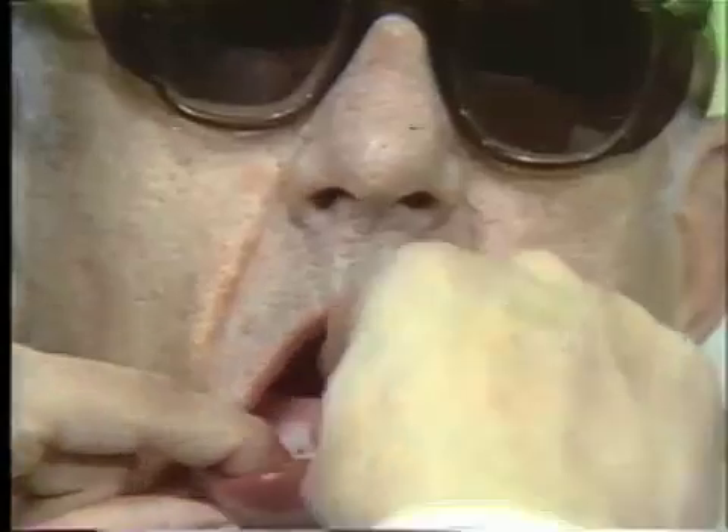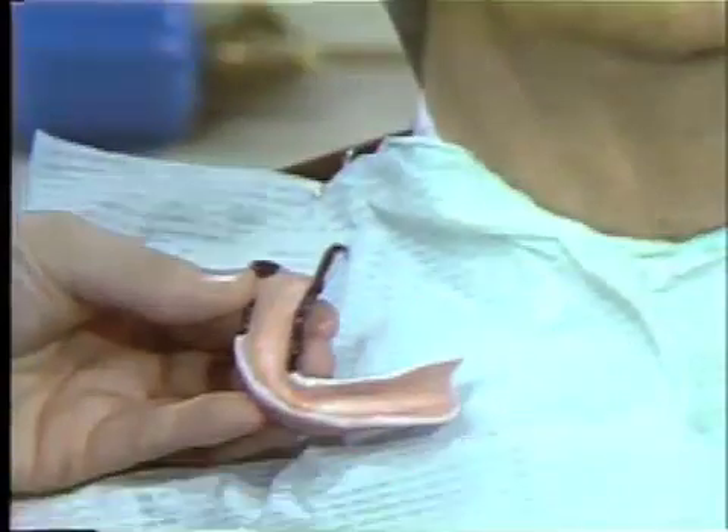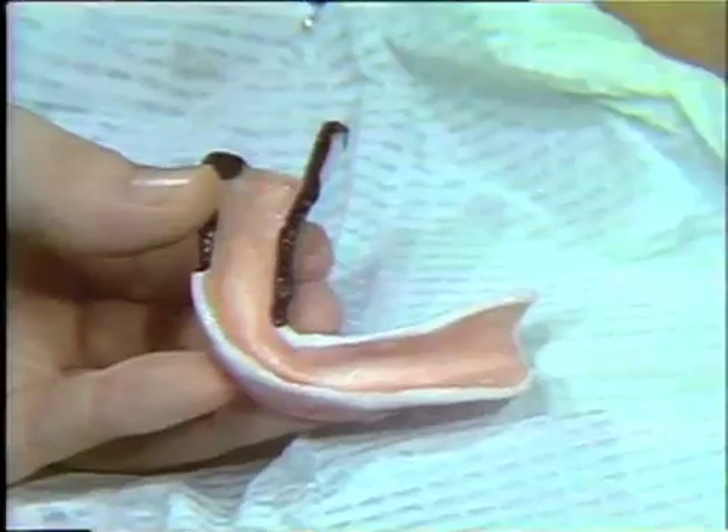Open real wide please. Seat the tray very comfortably. Ask the patient to raise the tongue — now just let your tongue down and bring it forward, let the tongue rest in the floor of the mouth and leave it there for a few moments. Then open again and remove the tray, and very carefully inspect to determine whether or not you are seeing a roll taking place in the lingual flange.